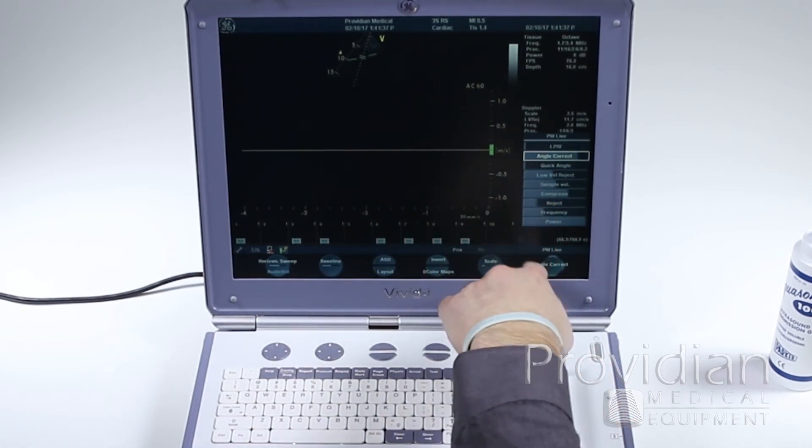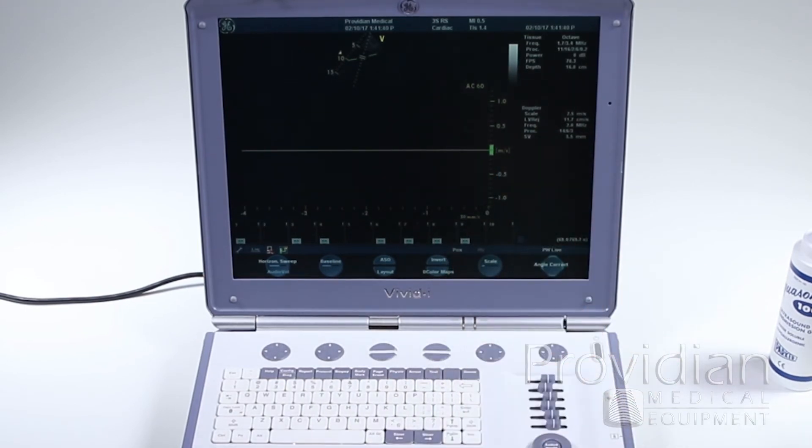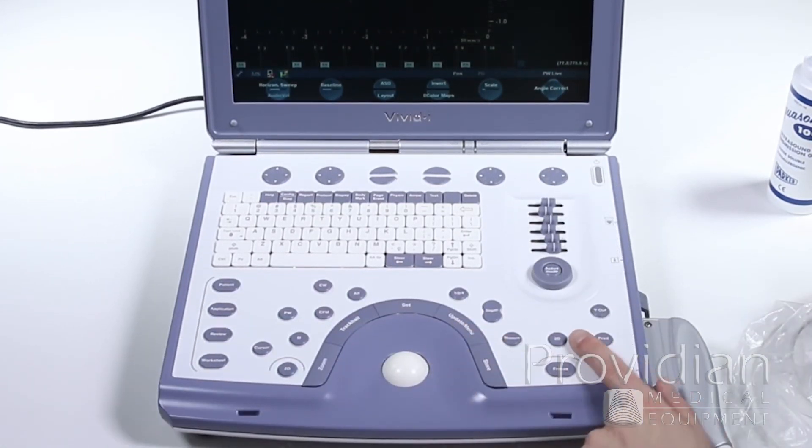This quick angle, low velocity rejection, sample volume compression rejection, frequency and power. Just the other image optimizations for while you're in 2D mode or pulse wave Doppler mode. You also have this 2D button here.